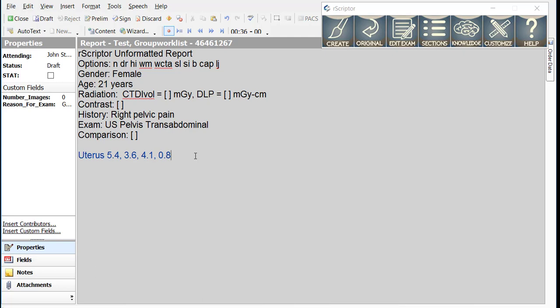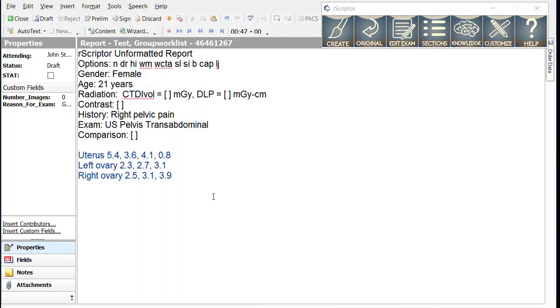New line. Left ovary 2.3, 2.7, 3.1. Next line. Right ovary 2.5, 3.1, 3.9. Next line. So with just a few words, we're able to dictate the sizes of the ovaries and essentially this is a normal report.